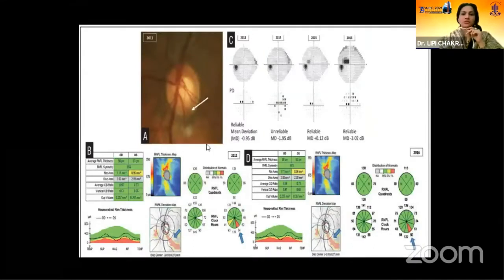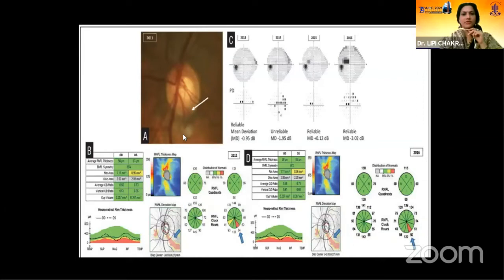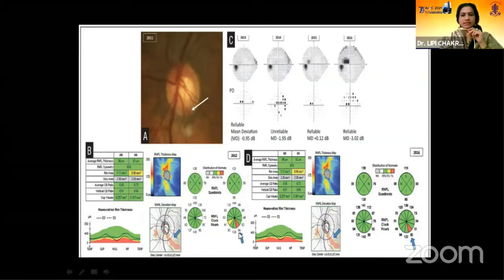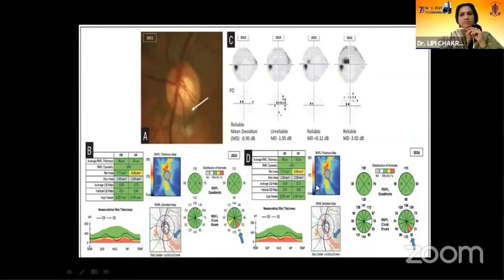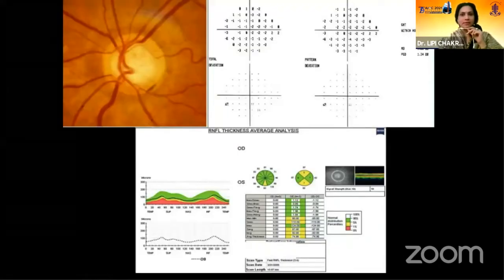Another example of progression — we are finding some thinning of the inferior rim. There is an artifact; the yellow one is an artifact. Perimetry when done has been unreliable. This 2016 reliable scan shows that when we do OCT, the thickness of RNFL is slightly decreasing from 64 to 50 microns. So this again might be progression — we need to wait and assess with other clinical parameters.